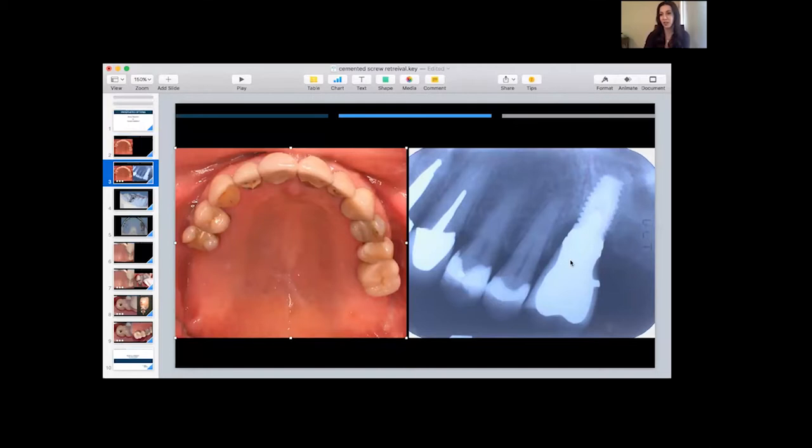What we're looking at is the dental implant with a custom abutment secured with a screw into the implant, and then a large PFM crown cemented on top of the abutment. The problem with this case is that the retaining screw connecting the abutment to the implant has come loose, which is why the entire crown assembly is loose. We want to gain access to the abutment screw without destroying the crown if we can avoid it.